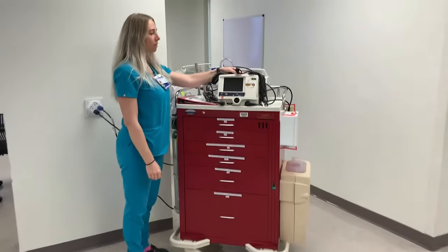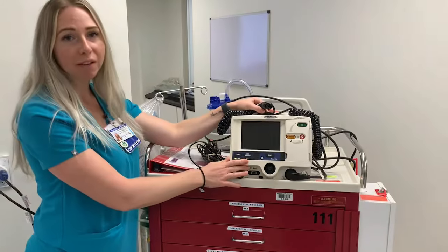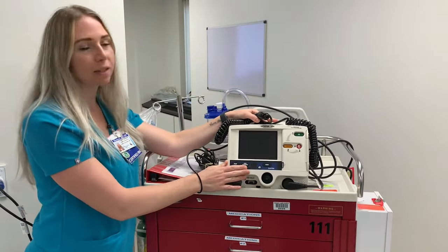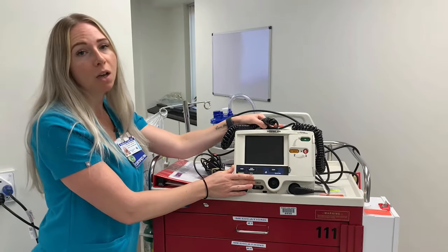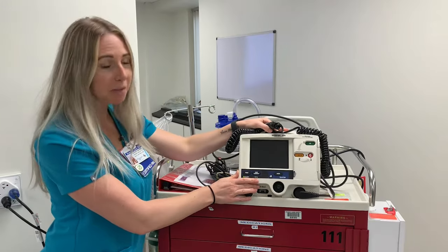The first and probably most important piece of equipment that we have here is the defibrillator. We're currently using the LifePak 20s, so you want to make sure that this LifePak is plugged in at all times. Whenever you grab the code cart to run to a patient's room, make sure you remember to unplug it.